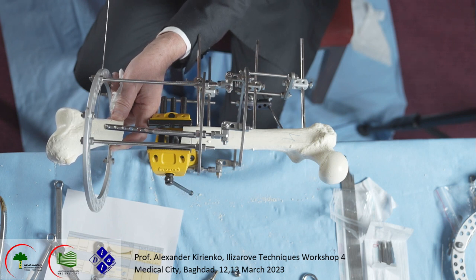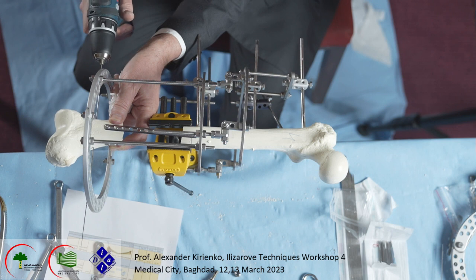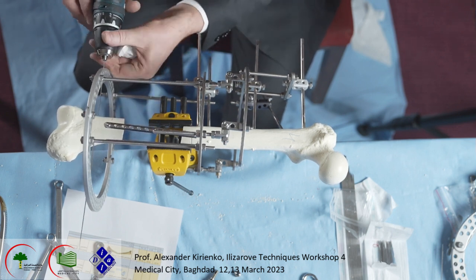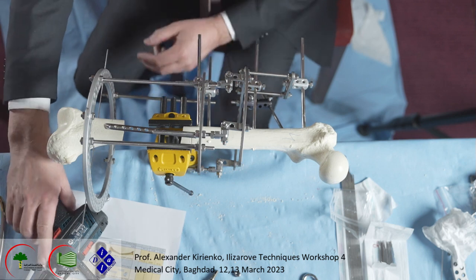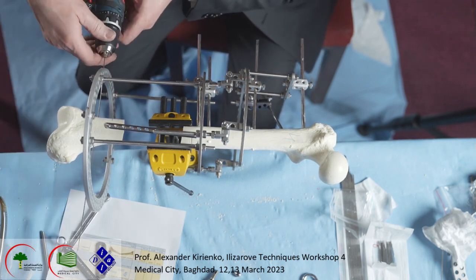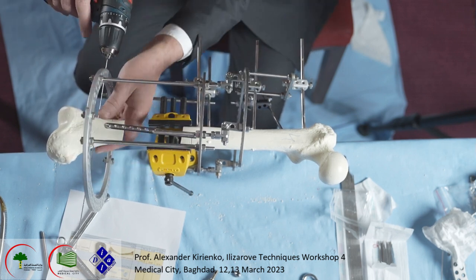In any case, you put the wire maybe like this, and you control the knee motion. If you see that the knee motion is not good, what you may do? You put the drill again, with all the skin tension here.